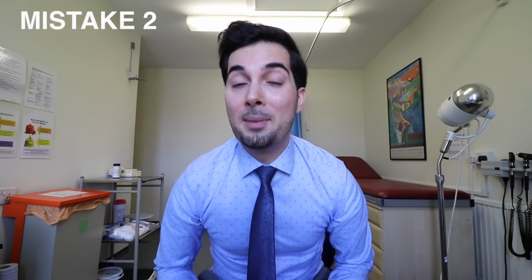Mistake number two, many people tend to use their right hand to spray in both nostrils, which is great for your left nostril because you're able to get the correct angle, which I mentioned earlier. But when it comes to your right nostril, you end up spraying into your septum, and that can cause bleeding and irritation. So, like I mentioned earlier, switch hands so you're able to get the correct angle.